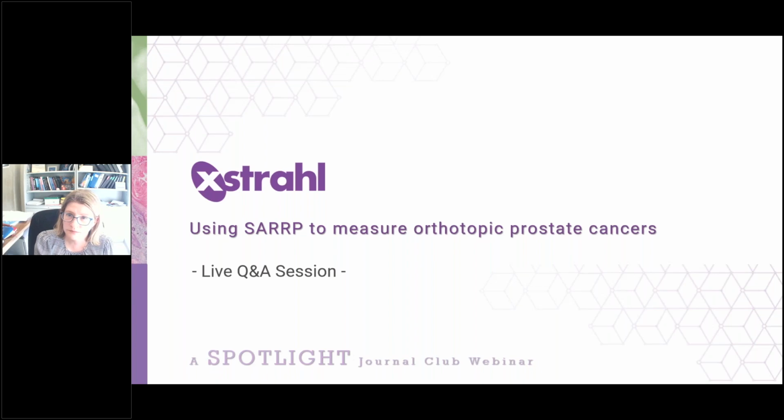What other tissue types do you think this method may be applied on, and what would you recommend to sites wanting to give it a try? As I mentioned before, we've done this with pancreatic cancer, and we couldn't see it when the tumors were small, but we could see them when they got larger. So we wouldn't be able to track them when they're really small, but we could see them when they get bigger.